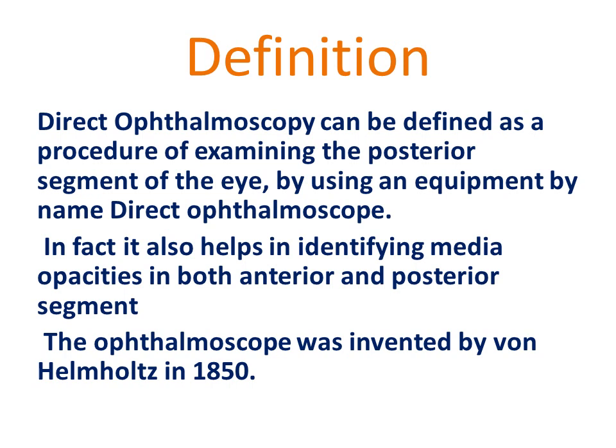In fact, it also helps in identifying media opacities in both anterior and posterior segment. So it's not an exclusively posterior segment examination equipment. Anterior segment details also to some extent are obtained by using this particular ophthalmoscope. The ophthalmoscope was invented by von Helmholtz in 1850.